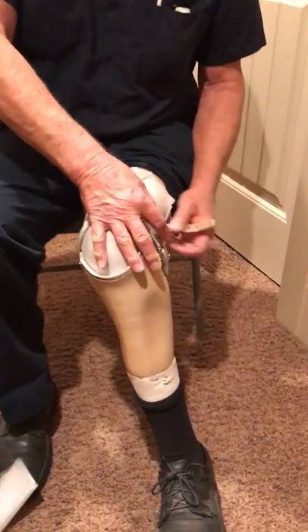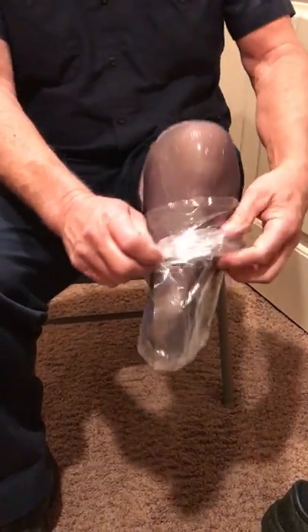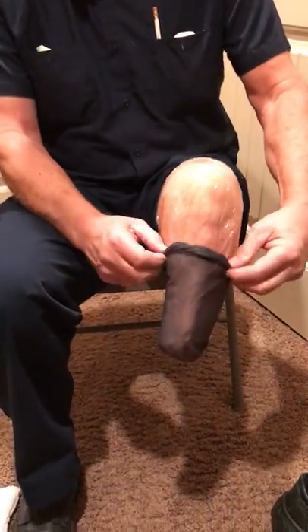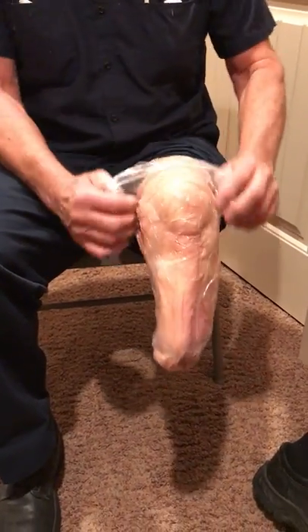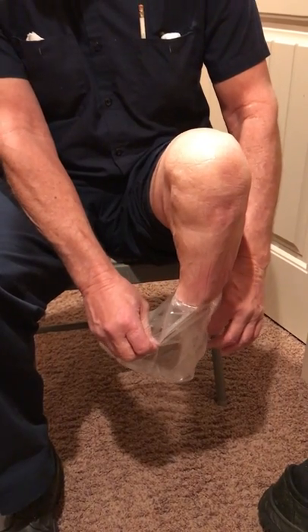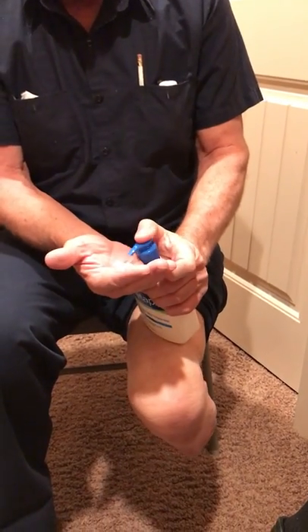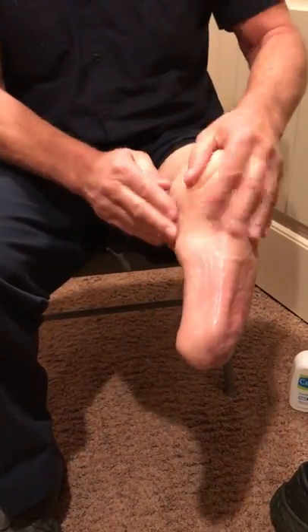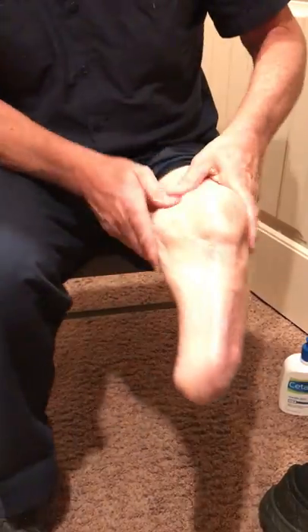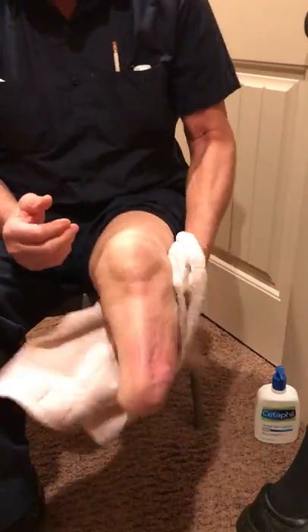So at night, when I go to bed, I take my leg off, take my socks off. These are plastic bags — I'm going to explain these to you. I have a nylon on — I'll explain that too. I take off my other plastic bag. When you pull this one off, pull it off easy because it sticks to your skin. Don't just yank it off, just pull it kind of easy. Then I take what they call Cetaphil. I put about that much in my hand, lather it up, and wash my stump with it. Then I take a towel and go to bed.